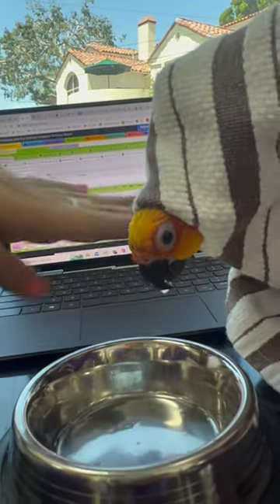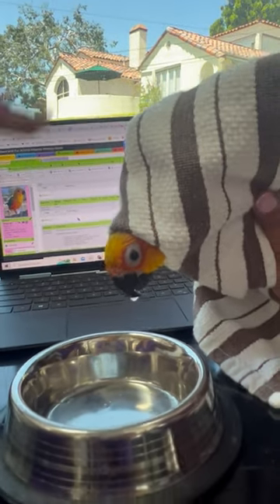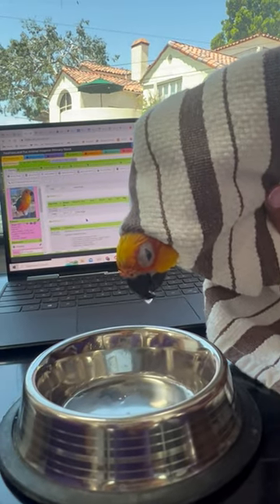Excellent. And then just leave her like this to let everything kind of drain out for another minute or two before we let her up.